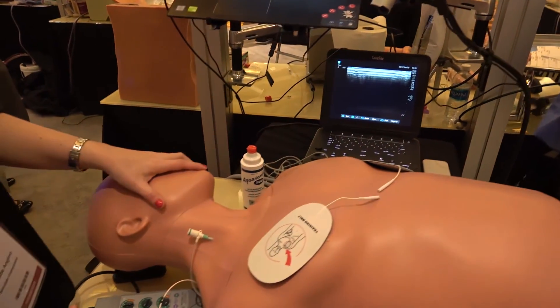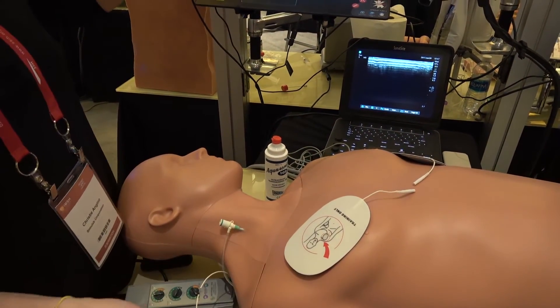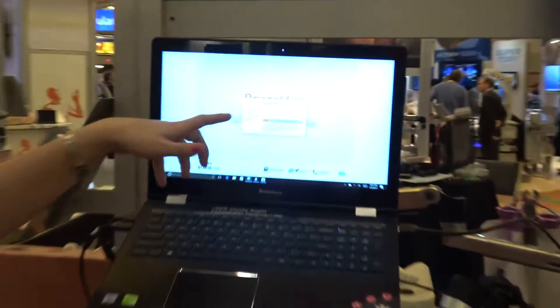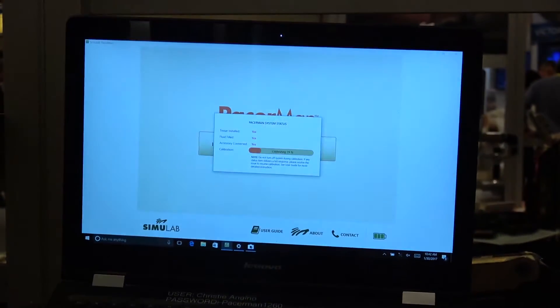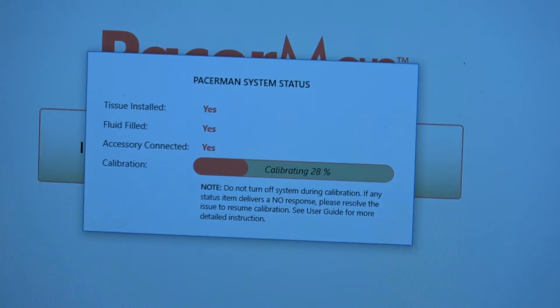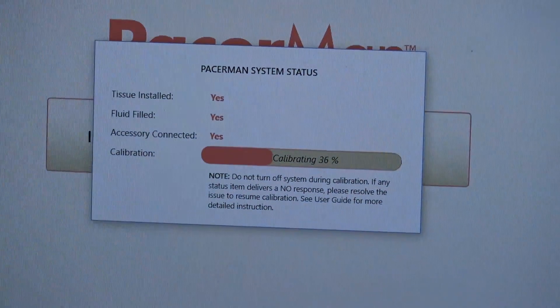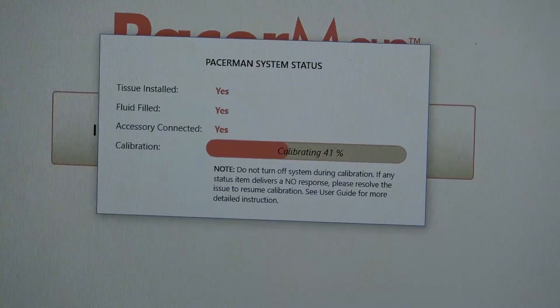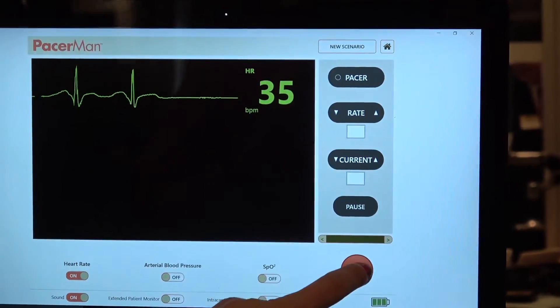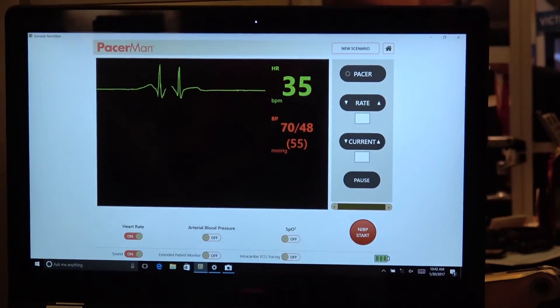The system also calibrates itself, so before we start the scenario we will know that the tissue is installed properly, the fluid-filled accessory components are all connected. When you're running the scenario, if anything is not working it's going to be something clinical — like the electricity on the generator not being set right. It also calibrates to move any air bubbles out of the ultrasound area.